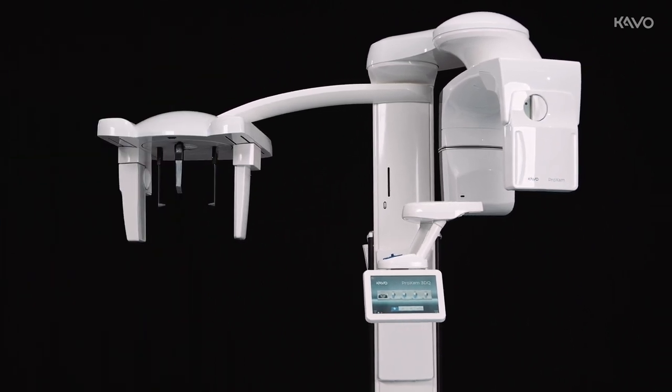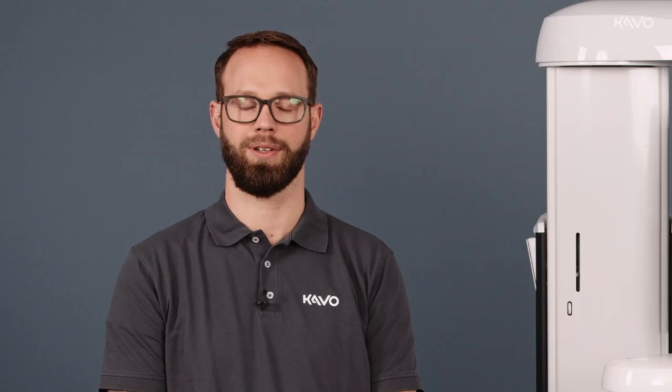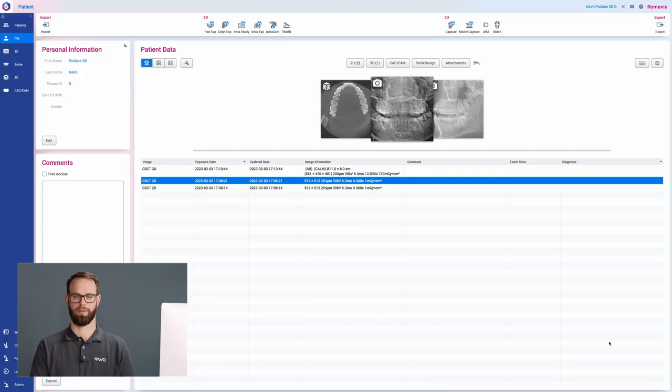Our ProXam 3DQ is a hybrid unit that we can use for all 2D, 2D Ceph, and 3D imaging. Correct positioning for 2D and 2D Ceph imaging is explained in our ProXam 2D videos. To start 3D imaging in Romexis, we click on the DVT icon.